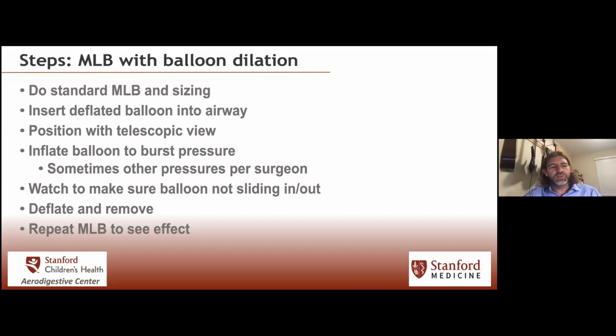So once you've got the balloon up, there's no magic time during which you keep the balloon up. If you're dilating the esophagus, and for those who treat patients with significant esophageal strictures, we tend to have a couple minutes time just because we're limiting ischemia. In the airway, we will bring the balloon up for a minute or two if the patient can tolerate it, or when they start to desaturate. Then we'll bring the balloon down and put the scope back in there and look and see what you've done, because sometimes you've done great things and sometimes you've caused problems. So you have to look and see what you've done.